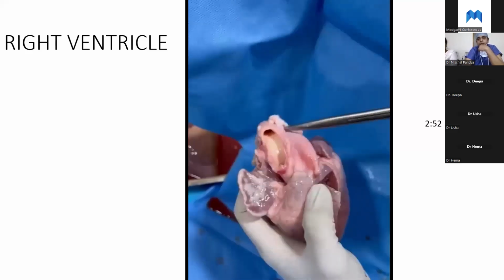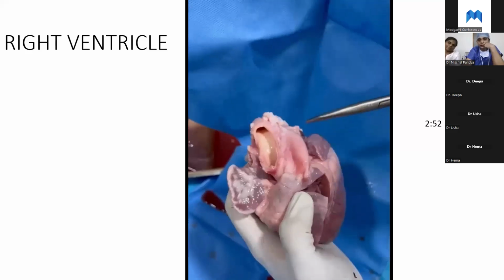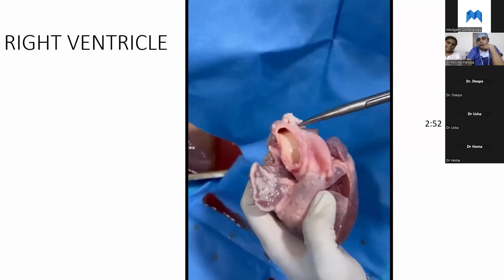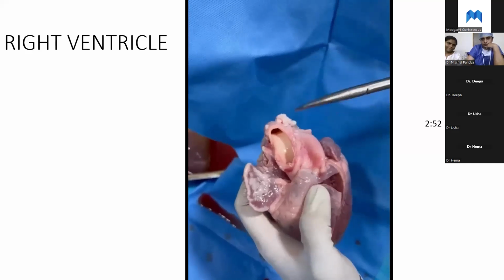Now looking at the pulmonary outflow over there, the right and left main pulmonary artery going to the right that I'm showing, and to the right. Sorry, is that not playing?